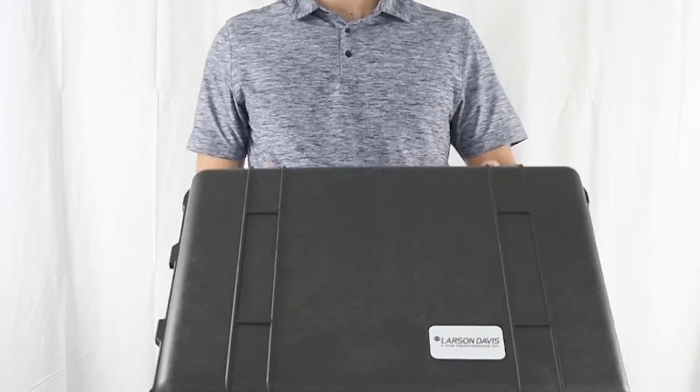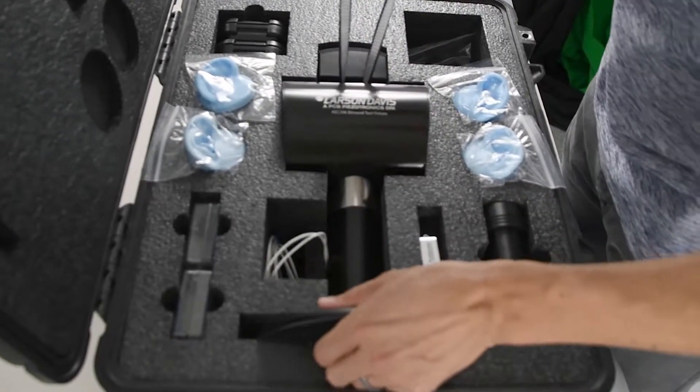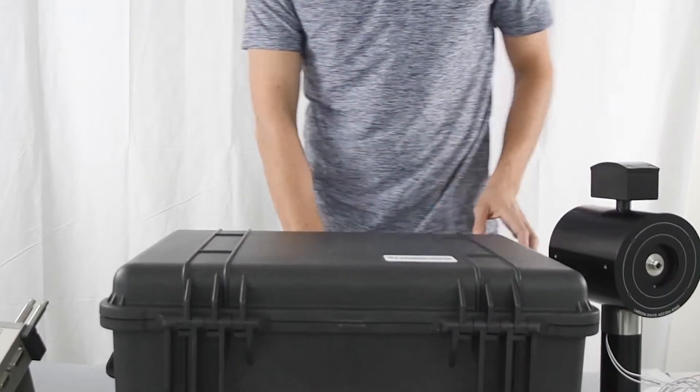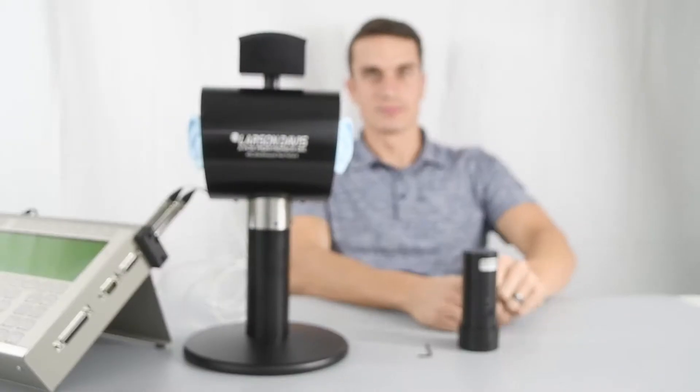Hi, my name is Dan Wilding. I'm an acoustic engineer at Larson Davis. Today we are going to perform an acoustic calibration on the AEC-206, something you might do before and after a regular test day.